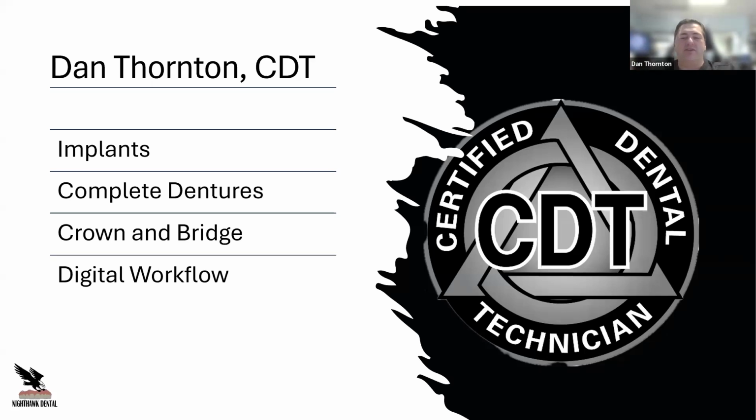Myself, I like to think while I'm actually there, so I like it when I do freehand, because then I have to pay attention a little bit more. Do we turn that implant a little bit more? Can we angle that abutment a little to the left, a little to the right? Can we change this? Can we reduce a little more bone in certain areas, to make the prosthesis flatter underneath, with a nice, cleansable intaglio surface? That way we can also control the tissue when it heals. If we have that nice flat surface underneath the prosthesis, the tissue will mimic it for your final, and it makes it a lot easier to clean later on, when we get to either the zirconium or the bar hybrids.